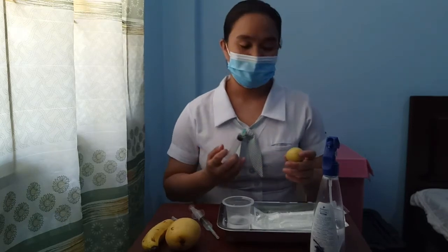Next is grasp the syringe in your dominant hand and close the hub, holding it between your thumb and forefinger. The rationale for this is that this allows for easy handling of the syringe. Like this. Next is hold the needle almost parallel to the skin surface with the bevel of the needle up. The rationale for this is that keeping the bevel side up allows for smooth piercing of the skin and introduction of the medication into the dermis.